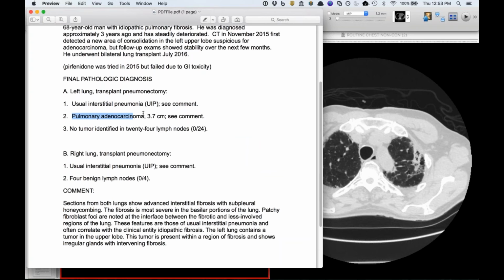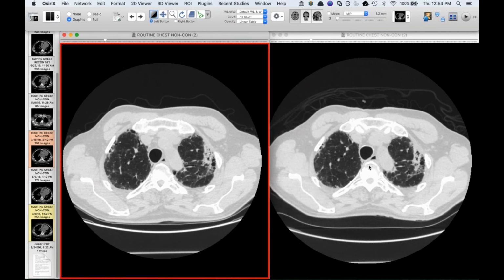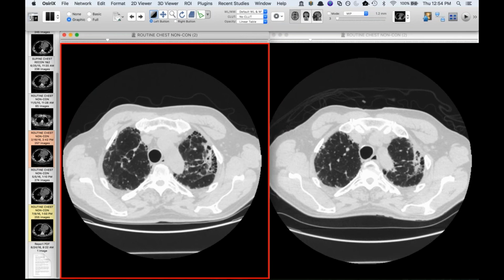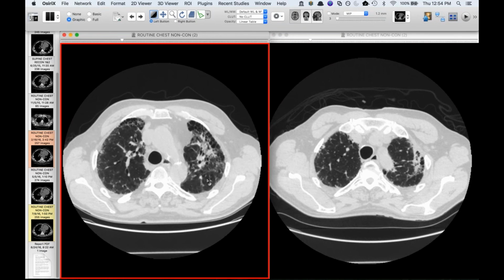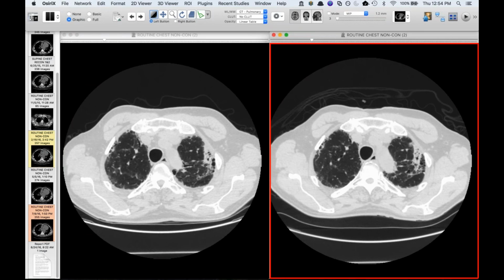Okay. Yeah, so this thing turned out to be an adenocarcinoma. So it kind of grew and then stopped growing and was fairly stable for 8 months before he went to transplant, and they took this out. And of course, these patients, they would have never really considered biopsy, just given his degree of fibrosis. But I don't know. I just find it confusing because cancer can kind of do whatever it wants.